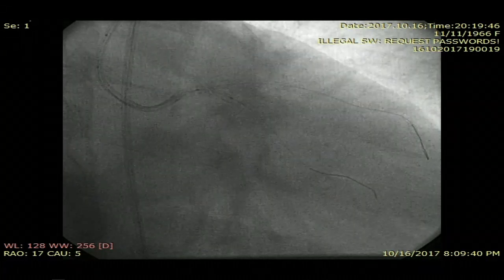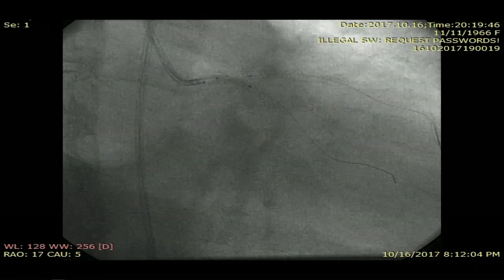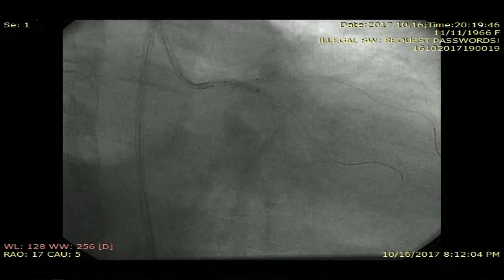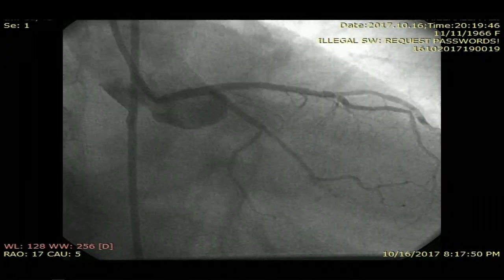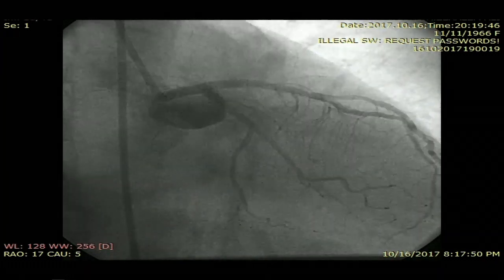We first dilated this stent, the CIRC, and then we tried to pass another balloon to do the kissing balloons, but it didn't pass smoothly. After passing it, we slid it over the second balloon so we could introduce it to the LAD stent. Then we did the kissing balloon technique to ensure the patency of both ostia, and this is the final result. The patient's follow-up remained uneventful with no chest pain, and showed good results over 1 year till now.